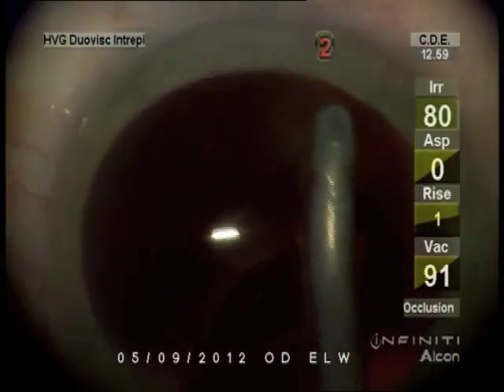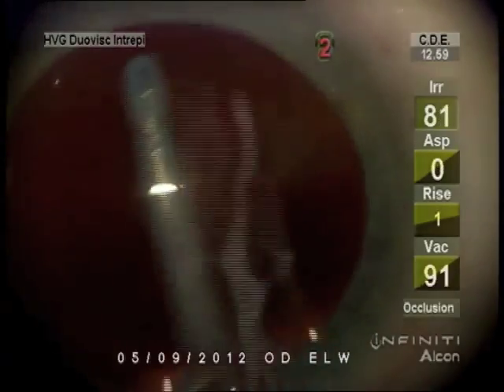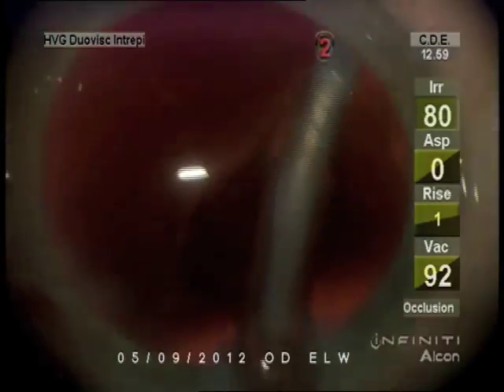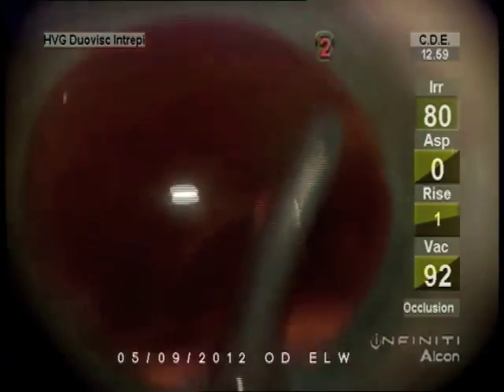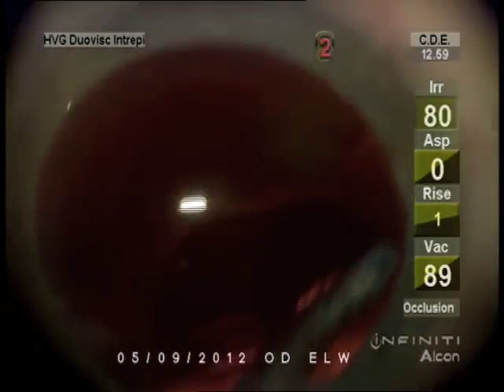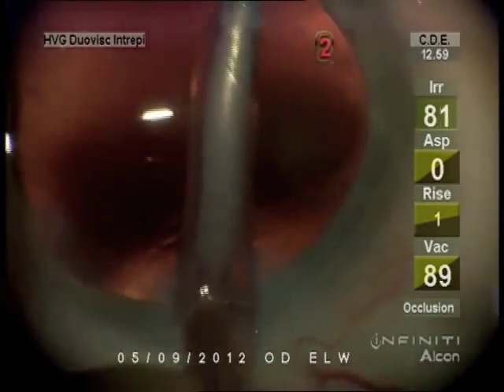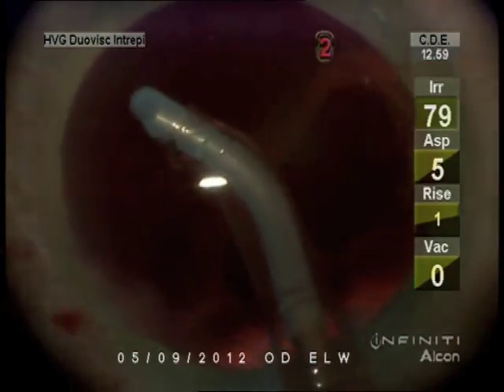We don't even use all of that to scrub the lens epithelial cells off. These aren't the cells that produce secondary cataract, but they do cause the fibrous metaplasia and phimosis of the anterior capsule. Polish, please.